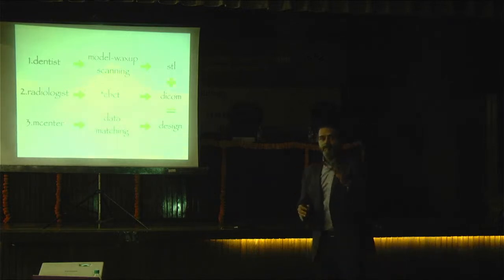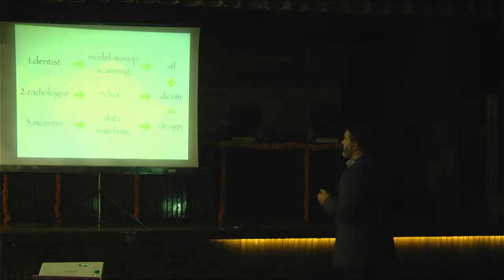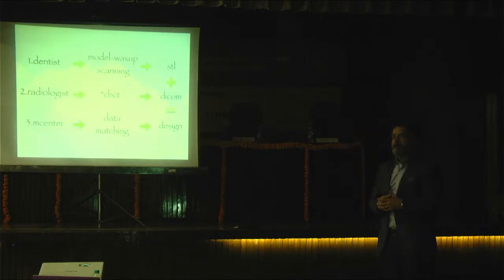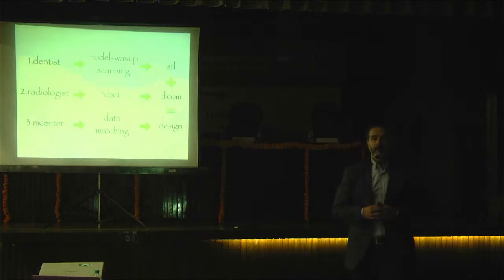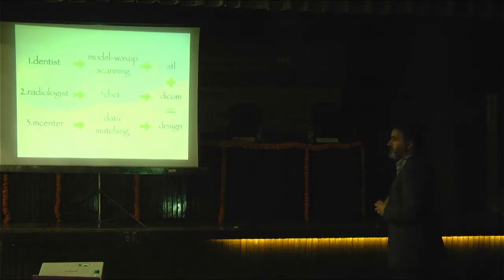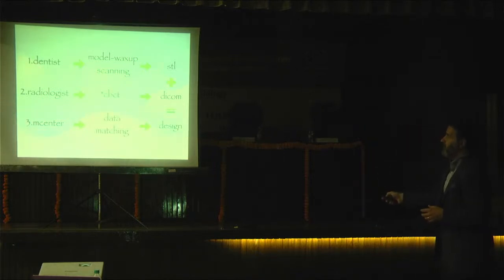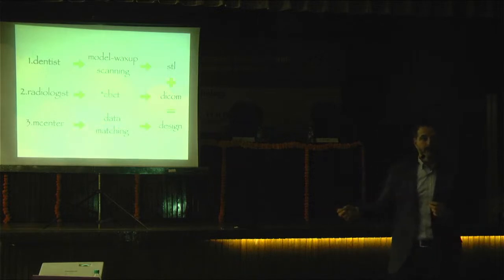There are three people: a dentist, the radiologist, and the M Center. We have some duties. The dentist first creates the model by having an impression and creates a wax-up scanning by the help of prosthodontic specialists, and then by the help of extraoral scanners, they have the STL files, and you send the patient to the technician, and you get the CBCT with some rules I will tell you later.